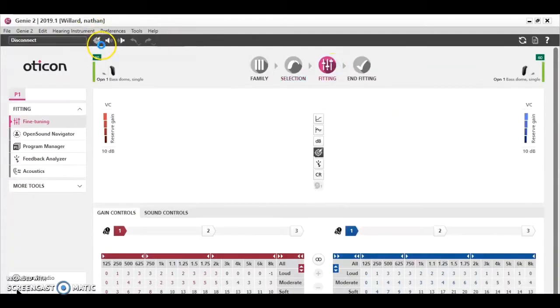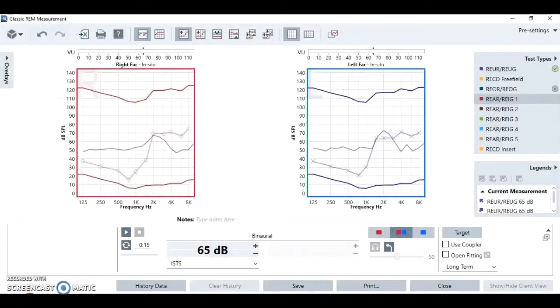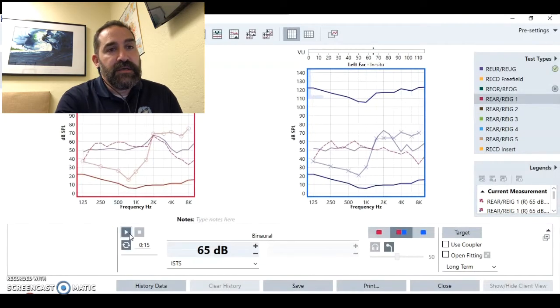I've got open domes on the hearing aids right now. I just told the hearing aids to fit to target. That target is based upon what I've said is my hearing loss. The first thing I'm going to do is turn the hearing aids off. With open domes, even with the hearing aids in my ears and turned off, it's just going to be as if I have nothing in my ears. So we'll see what happens when the hearing aids are turned off.